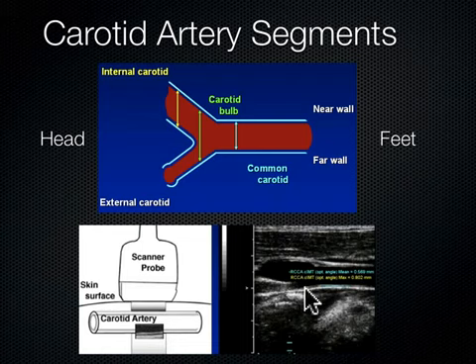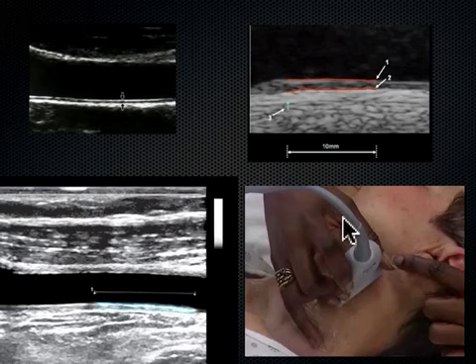We call that the far wall. Why do we say that? This is near, this is skin line, and this is looking distally down here. This is far, and so we're going to use the far wall. Because check it out. It turns out that when sound goes through blood, blood is a low attenuating structure. Think back to the physics talk, right? Low attenuation, sound loves to travel through fluid.